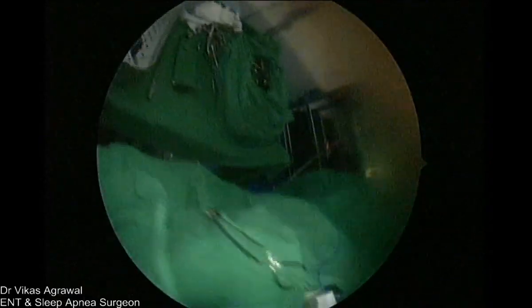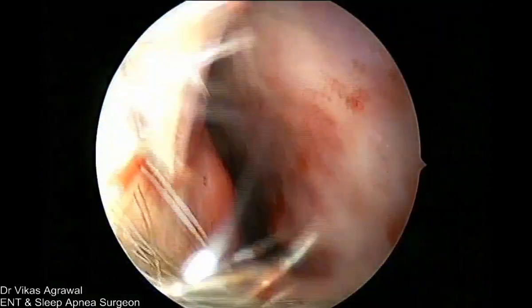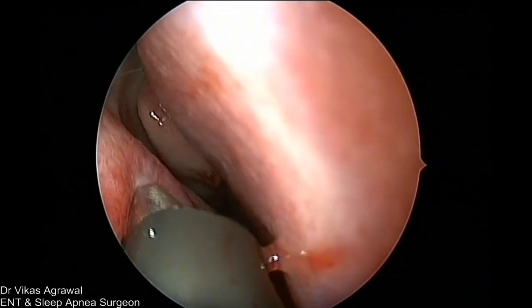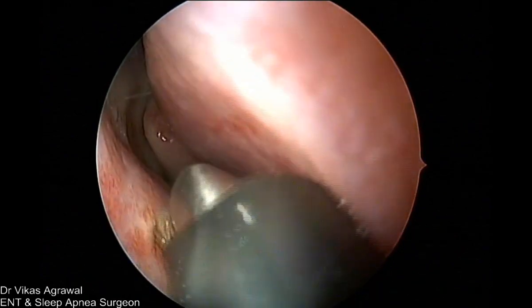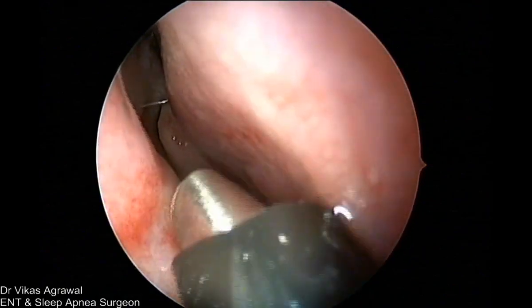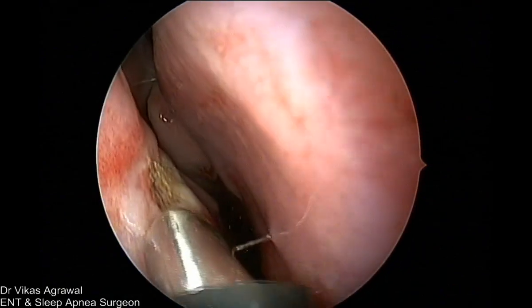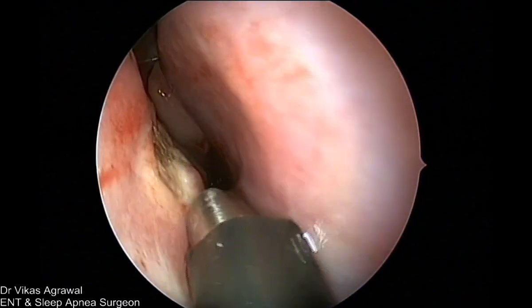See the anterior part. Coblation ready. The anterior upper part. This is the bulbous part. This I am just coagulating. So you can do a submucosal diathermy as well. But I have realized that doing this, though there is a little loss of mucosa, this is much more easy on the patient than doing a cautery.